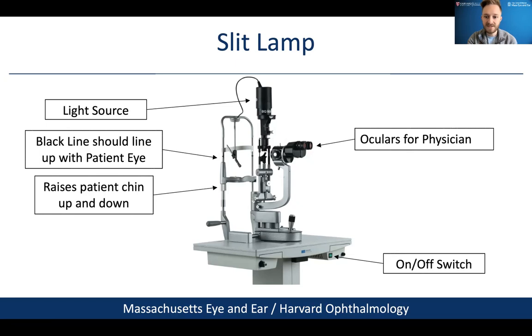Now look through the oculars. This is for you to look through. The oculars are the perspective viewer of the slit lamp microscope.